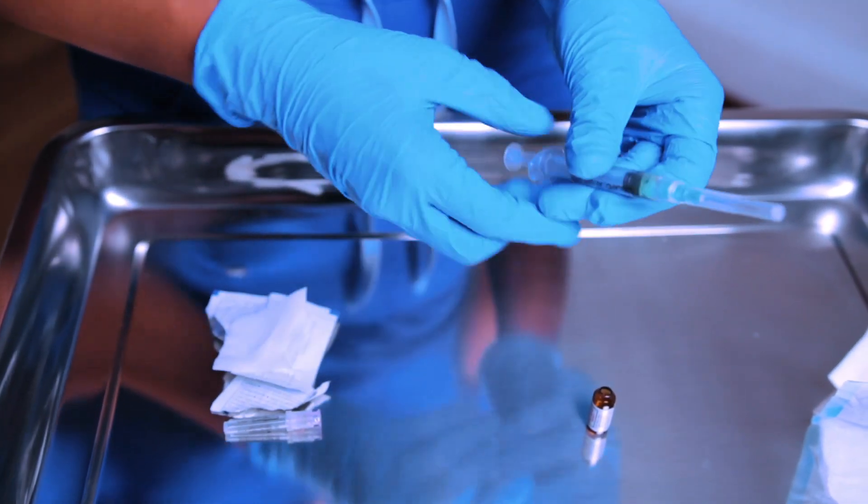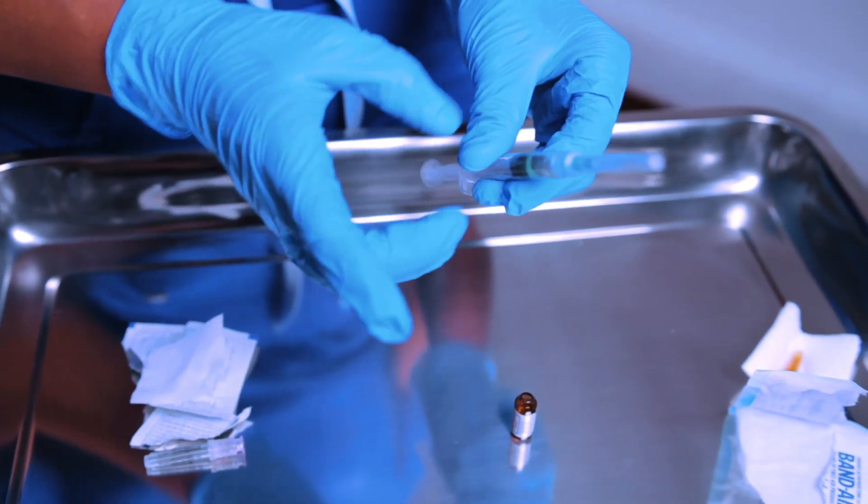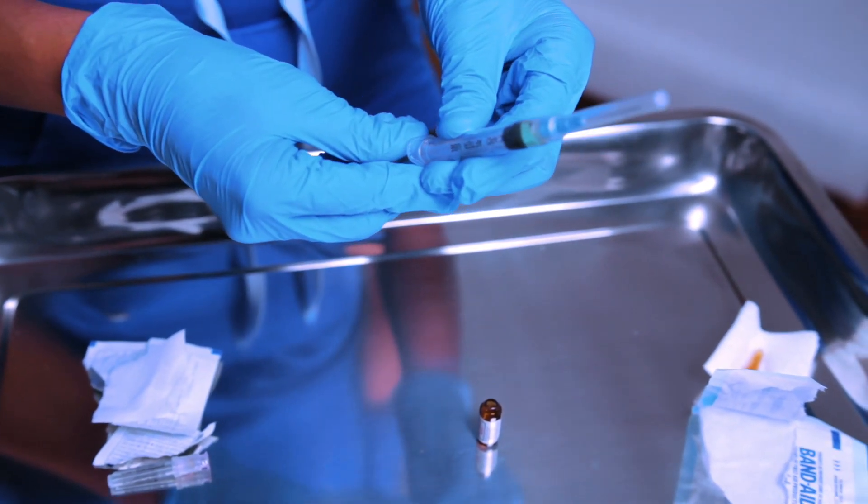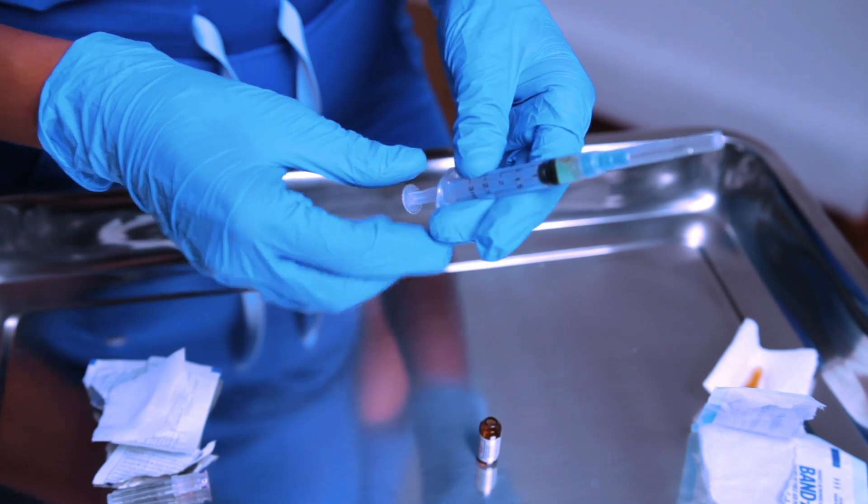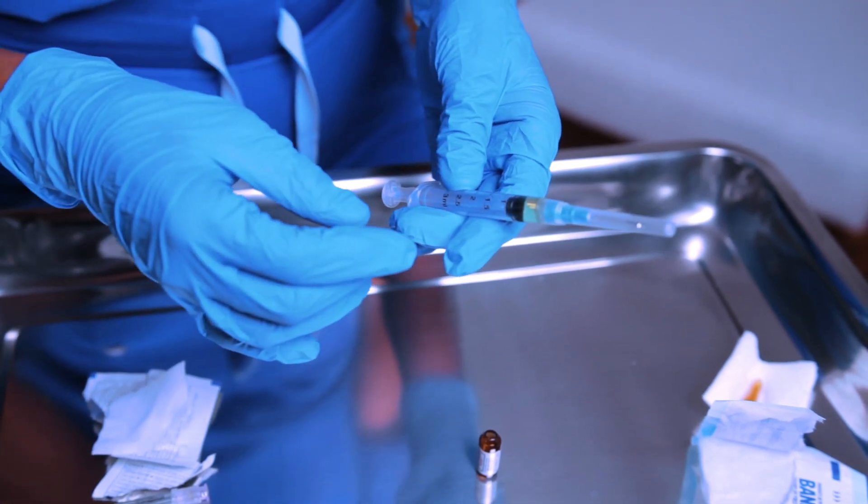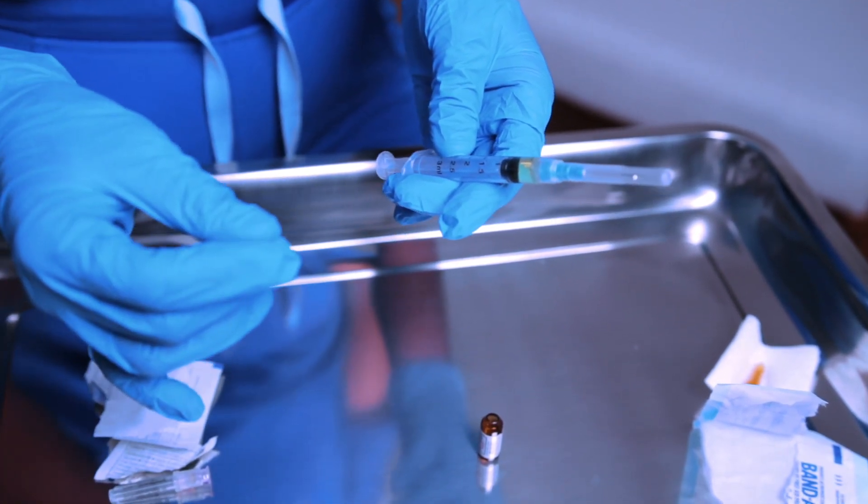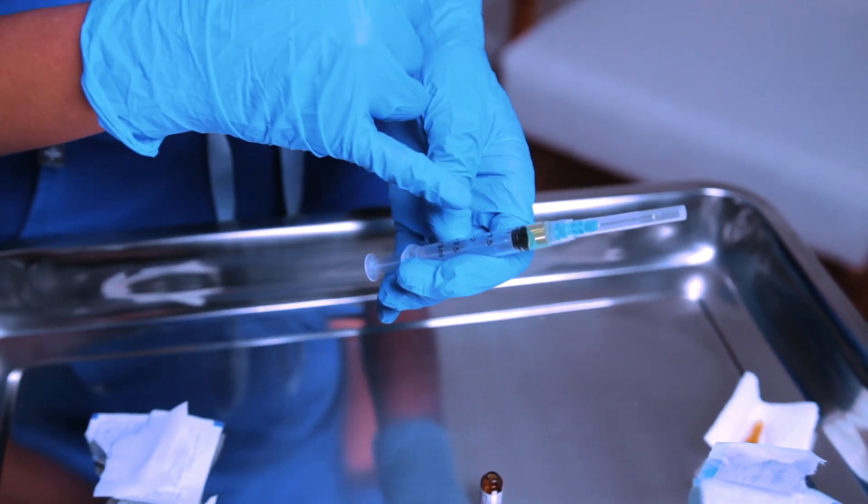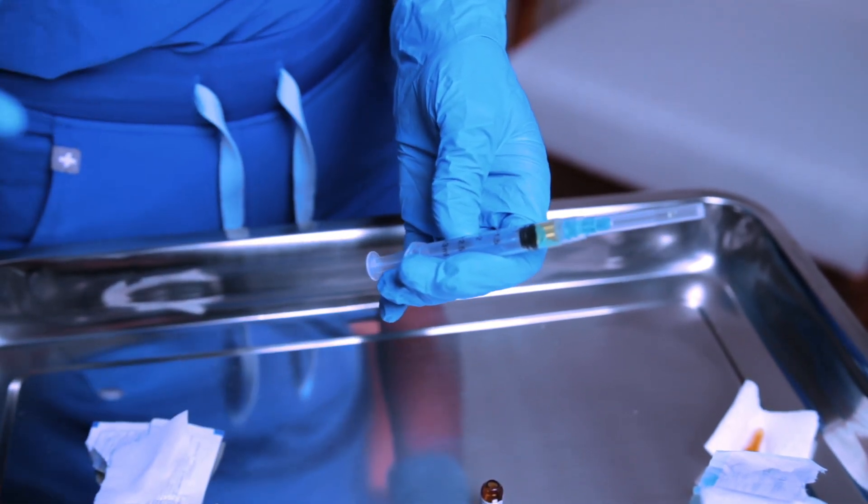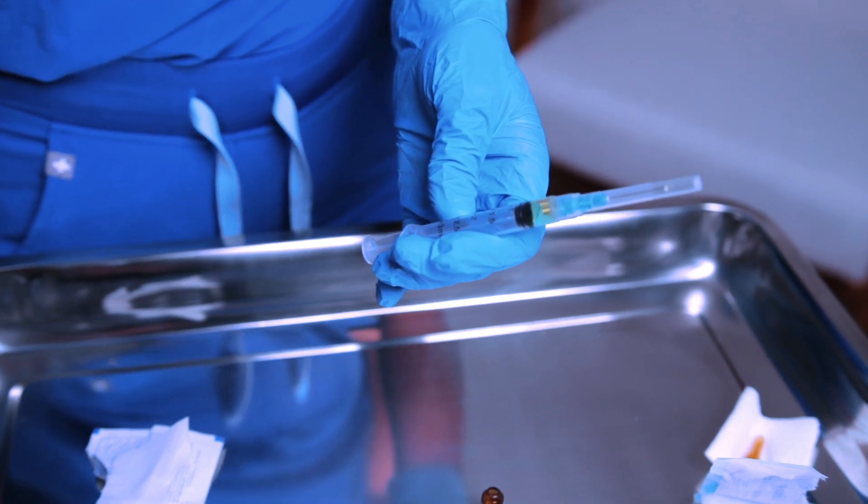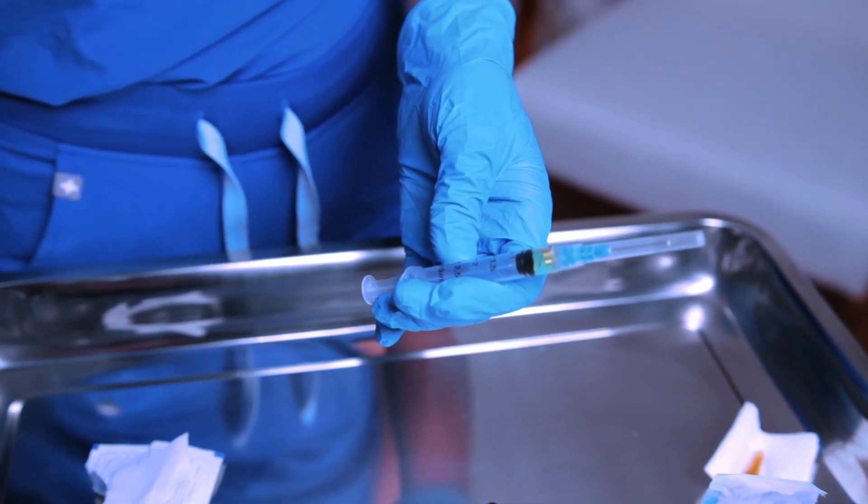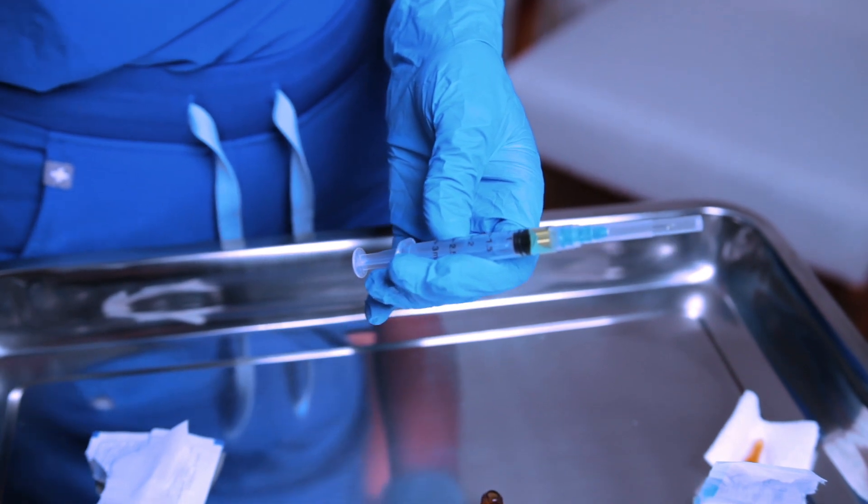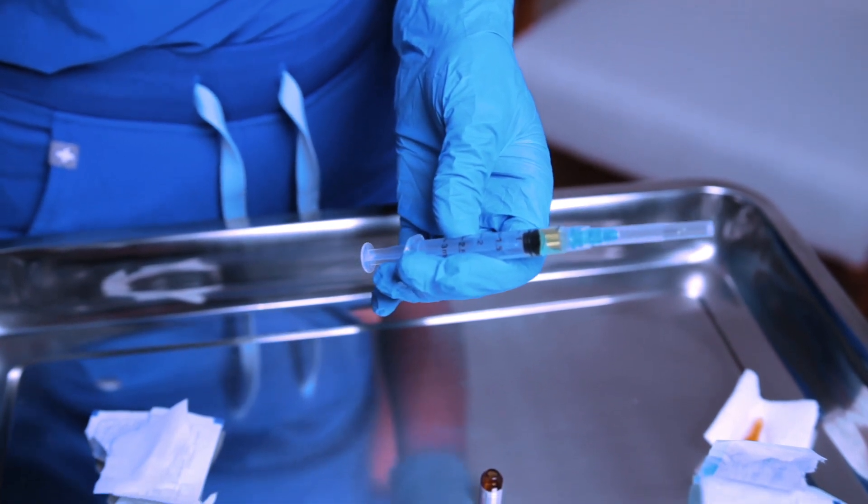I just want to make sure that there's no air bubbles in here. And so if I have to kind of tap it a few times, then I will do that. But this medication is a little bit on the thicker side. The texture of it is a little different. But here is 0.5 mils. Based on your protocol, you may have to co-sign with a second RN if it is a pediatric population. However, you always refer back to your hospital policy.